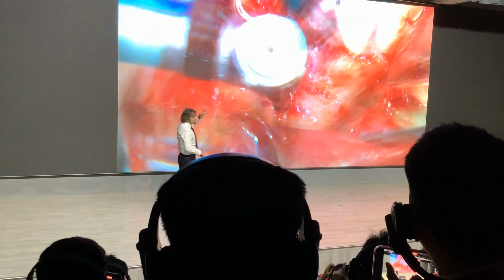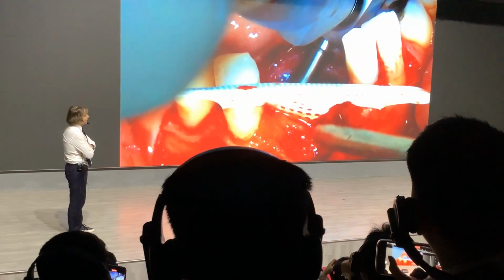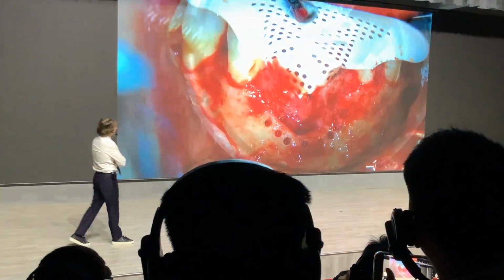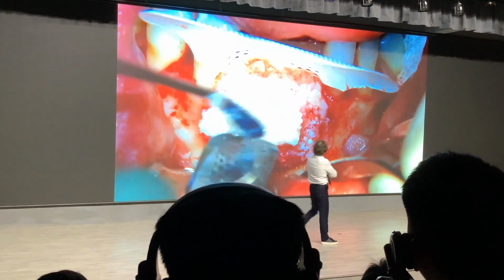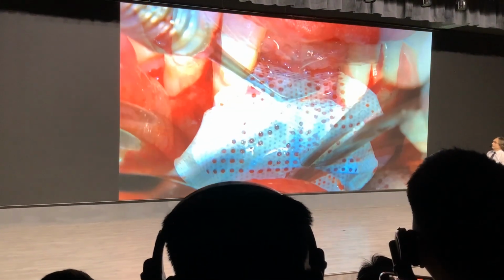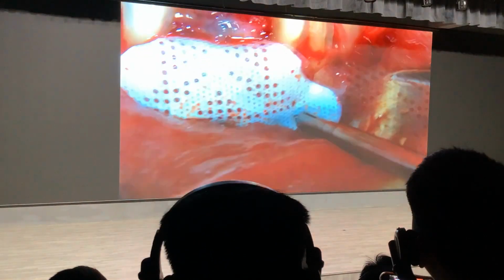Then I'm going to fixate the membrane on the lingual with a screwdriver and a handpiece. 2 screws. Then I can place the bone graft. Okay, I'm not going to show the full closure here, you will see it after. That's it. Okay, we got the membrane in here. Put a screw or a pin. You have Mazinger here? Mazinger is here. Yeah, so master pins.